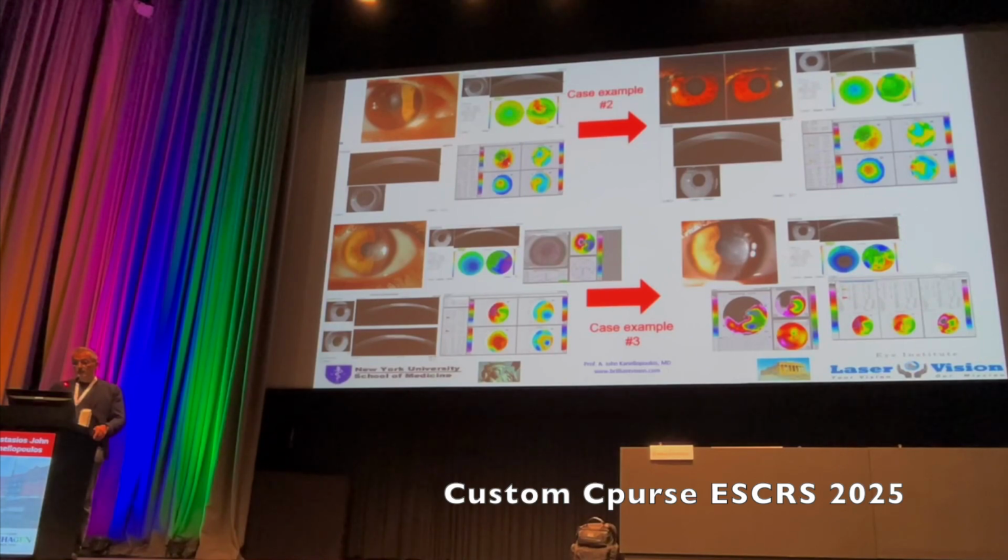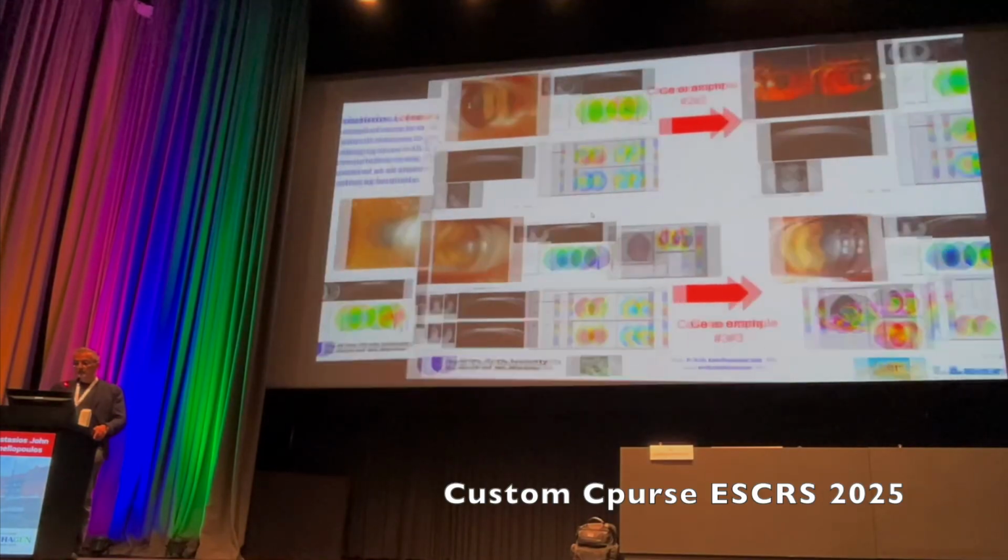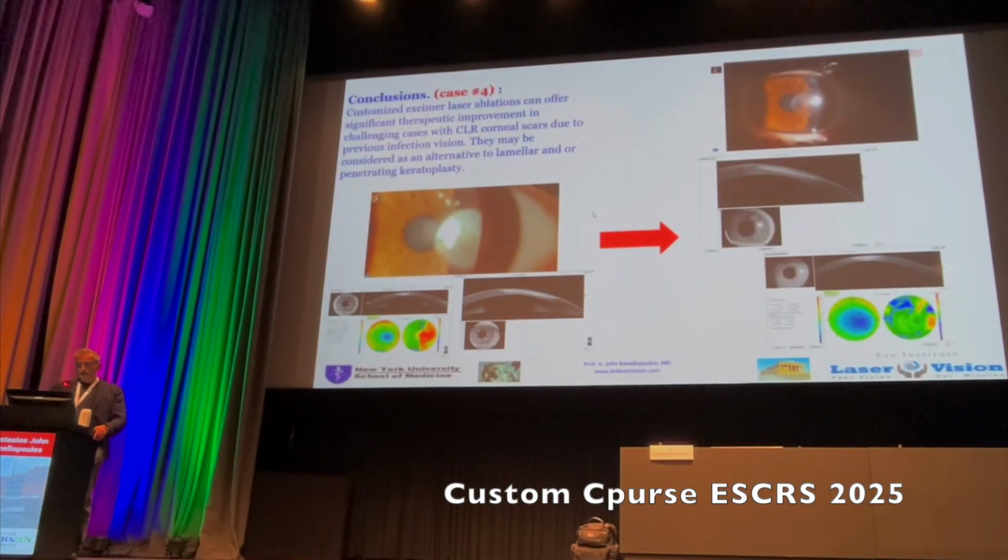But the interesting thing is that the cornea is not thin here. The cornea is thin here because of the scar. So this is the attempt to treat these irregular eyes. This is another one. You can see how dense the scar is, and how deep it is, and how with this treatment, I think in this treatment, we also combined cornea cross-linking in order to address the fact that we thin the cornea quite a bit. And we have found that CXL also reduces cornea scarring.